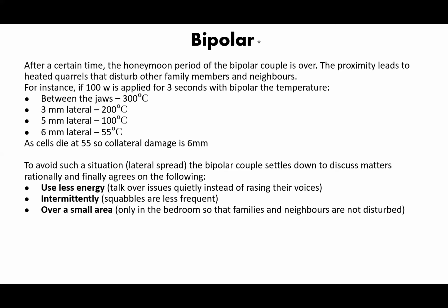Intermittently, okay? Sparks or arcs are less frequent, so you can use it intermittently. Don't just hold and press for a long time. You can see the effect it produces in just 3 seconds. Now, overall, use a small area.